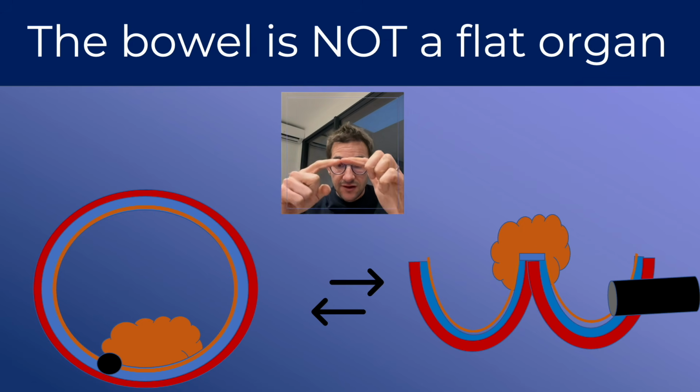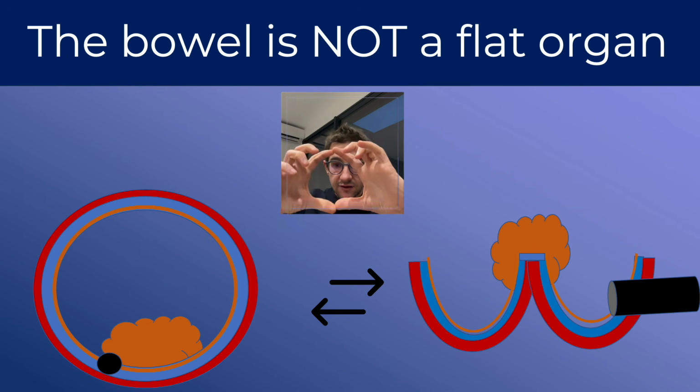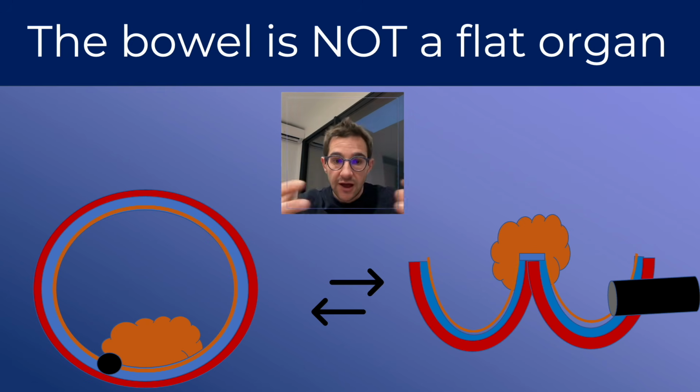In the esophagus it's a very short circle and it's larger in the colon, and therefore your line should follow the shape and the anatomy of the bowel where you are dissecting. You will try to adapt yourself to the shape and the curve of the digestive tract.